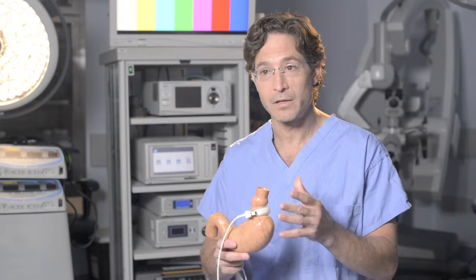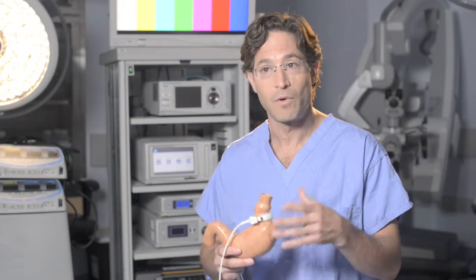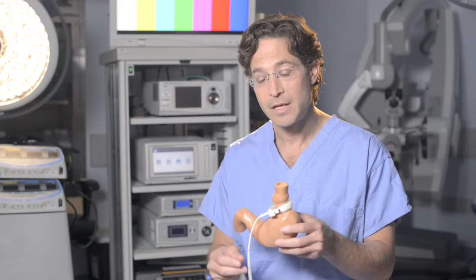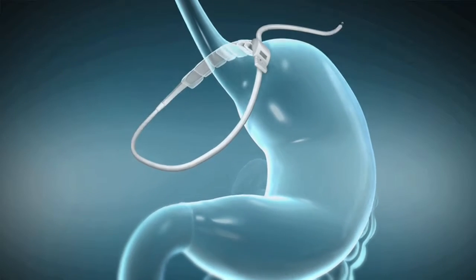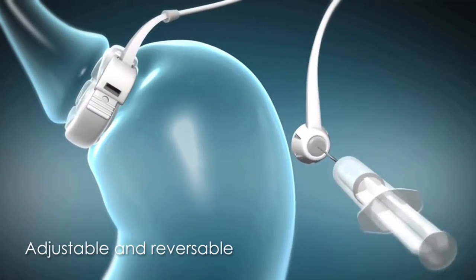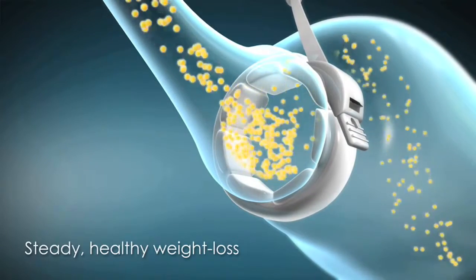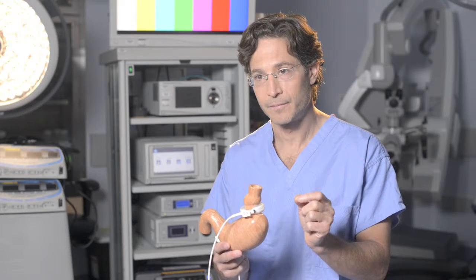A lot want the least aggressive approach to achieve their weight loss. They don't want to change their anatomy at all. They want something that's reversible. Well, the band achieves that very well, and that's what's unique about the band. So we place the band around the upper portion of the stomach. We achieve a certain compression that's appropriate for the individual, and once we achieve that compression, we get our objective of portion and hunger control.